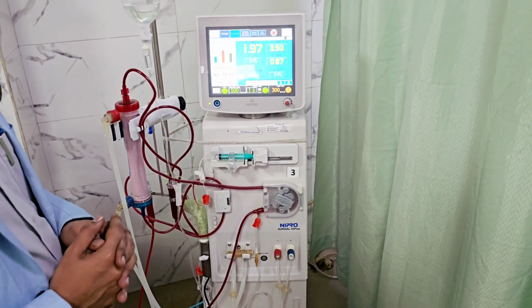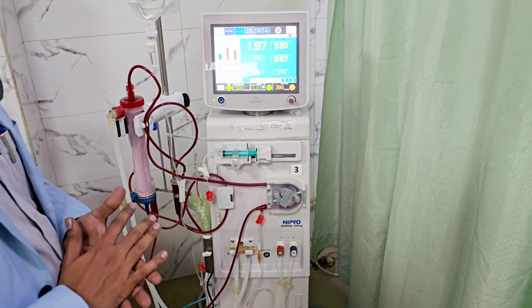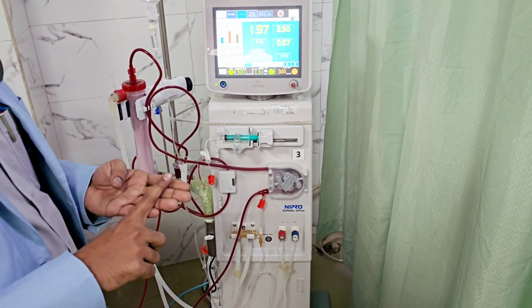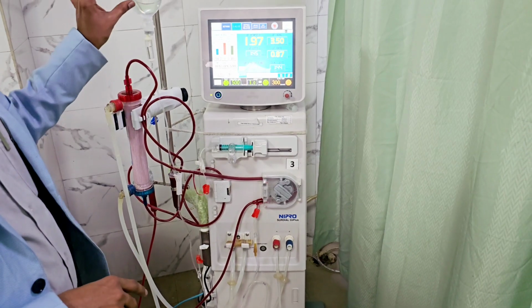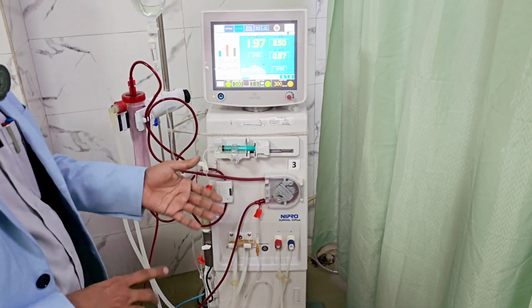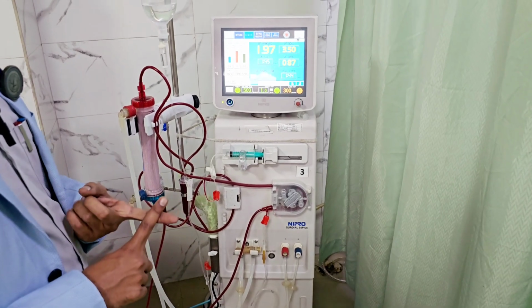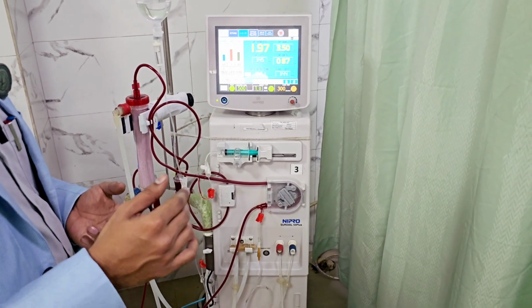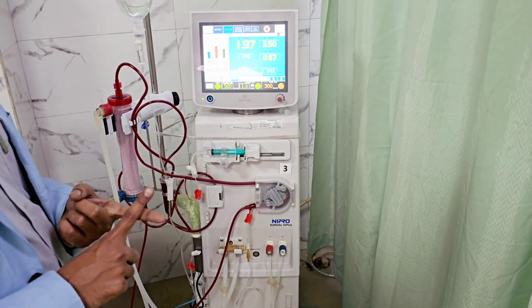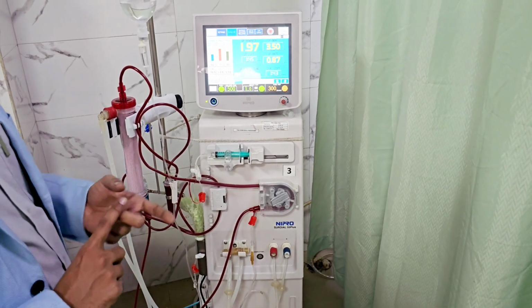For example, in a patient, if we have to remove 2 liters of water during dialysis, if it is heparin-free and a 4-hour dialysis, we have to take into consideration how much ml of normal saline went inside. It has to be added to the 2 liters. The final should be 2.8 to 3 liters removed. So this is one adjustment to prevent the clotting. The second one is the blood flow.